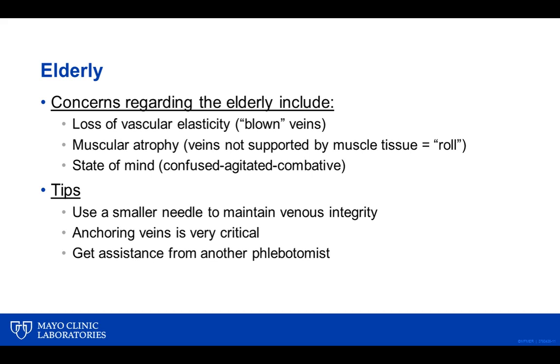I like to get my body right in line with that vein I'm going to stick. I'm trying not to stick from off to one side or the other. I want to come in right on top of it. So I'm looking straight down the needle, right where I'm going to stick, and make sure it pops right into that vein.